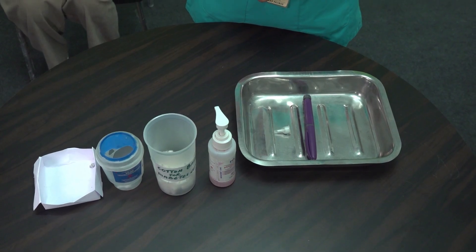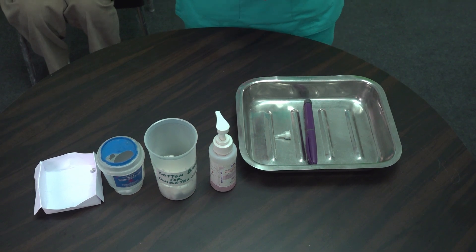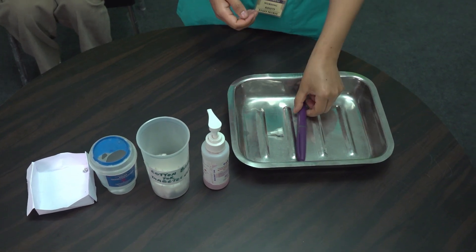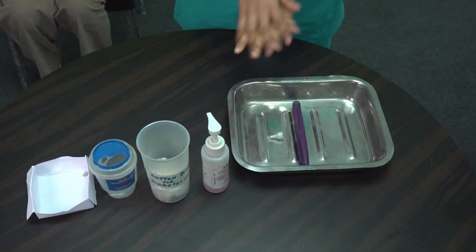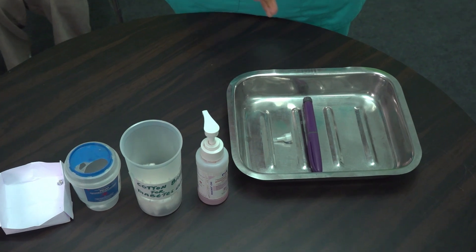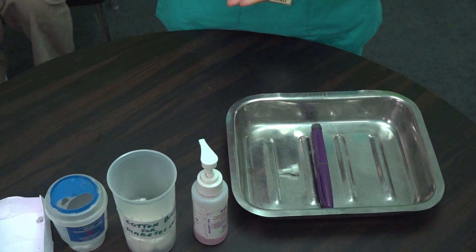Now let's go to the procedure for administering insulin using an insulin pen. Wash hands thoroughly with soap and running water for at least 20 seconds. If unavailable, use a 60% alcohol-based hand sanitizer.